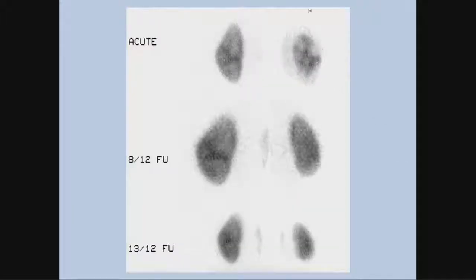And this is a diffusely involved kidney with diffuse abnormal uptake. It resolves on the 8-month scan, no residual scarring, but on follow-up, that kidney's not growing as well as the other kidney. So what are the features of renal cortical scarring?